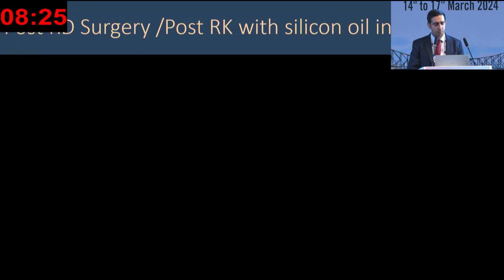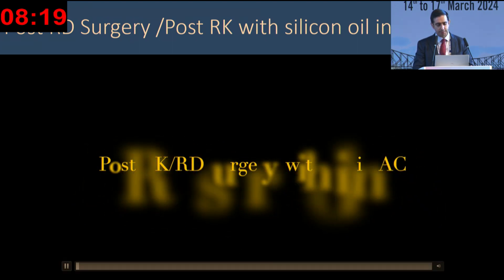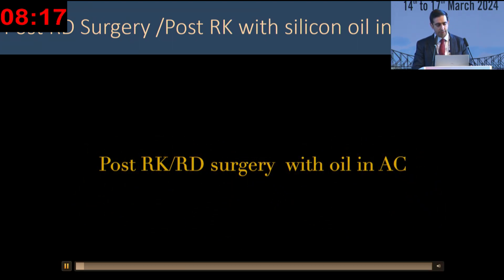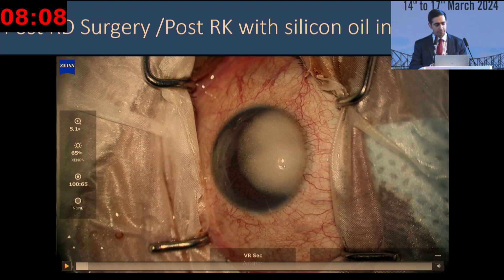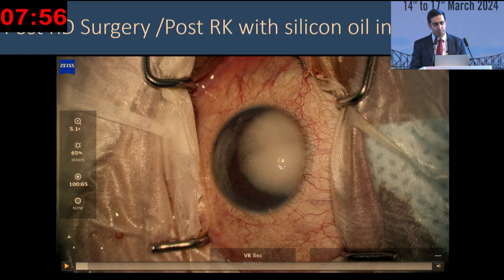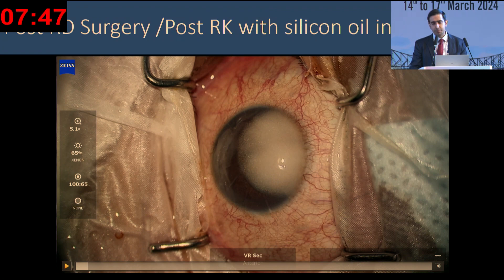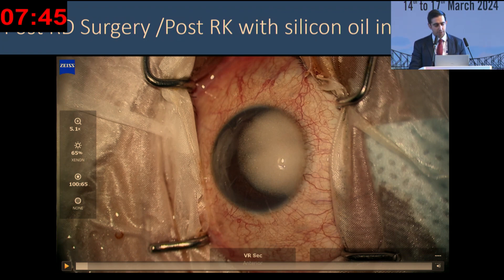The second case is that of a post-RD surgery with RK marks with silicon oil in the AC. The first thing to draw attention to is that this is actually silicon oil sitting in the anterior chamber. This patient had had a vitrectomy done earlier, and this is emulsified silicon oil. To complicate matters, the patient had about 12 RK cuts as well. My first job in this was actually to wash out the silicon oil.